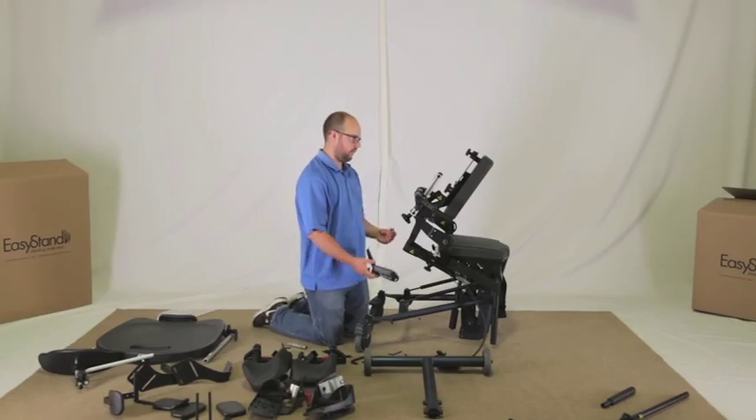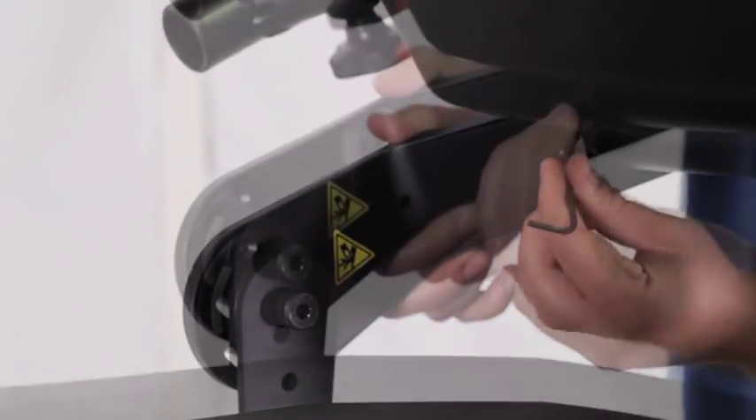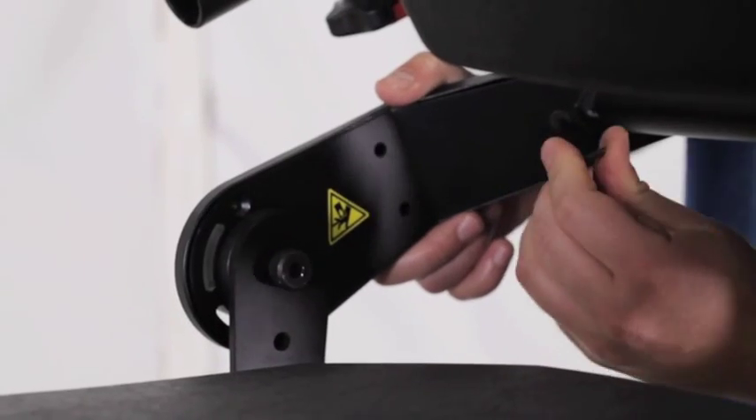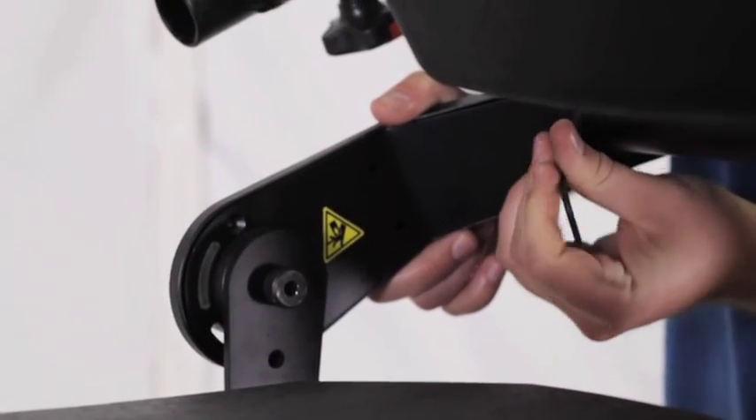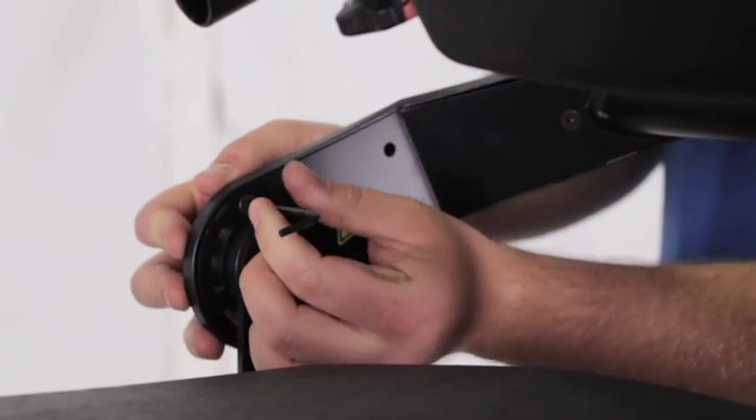There are three small bolts to remove on each cover for the hip pivot. Place the cover back onto the unit. Replace the back side bolt and tighten securely. Replace the top bolt and tighten securely. The third bolt will be installed later.